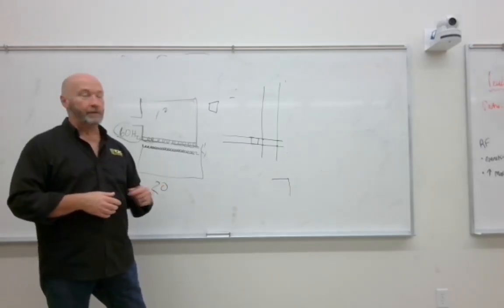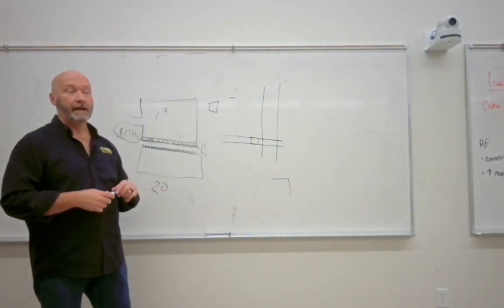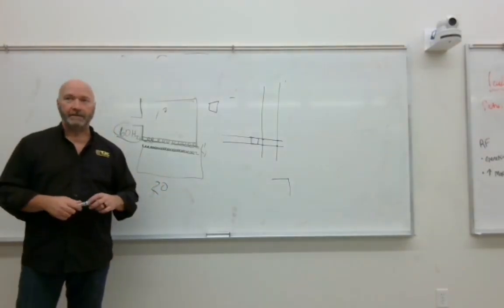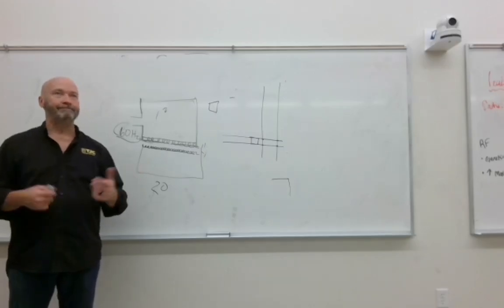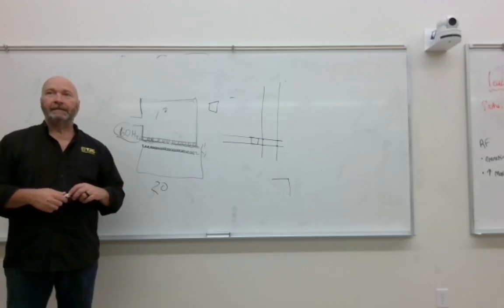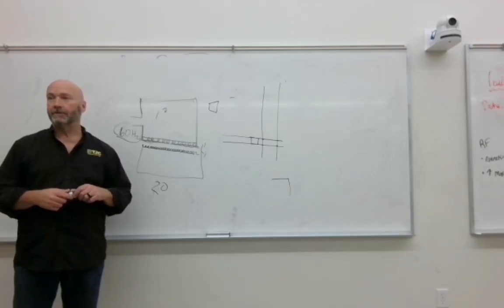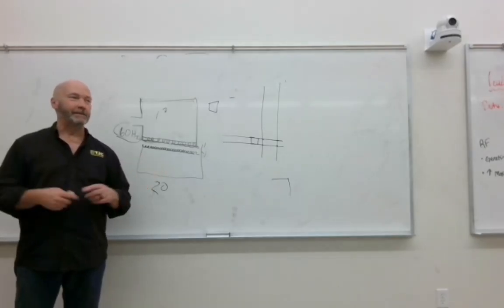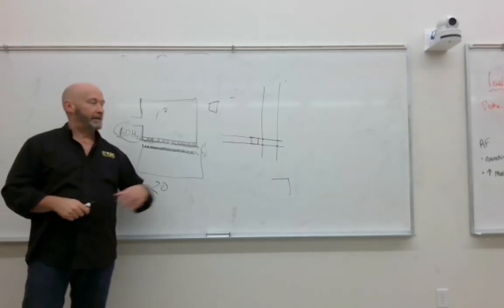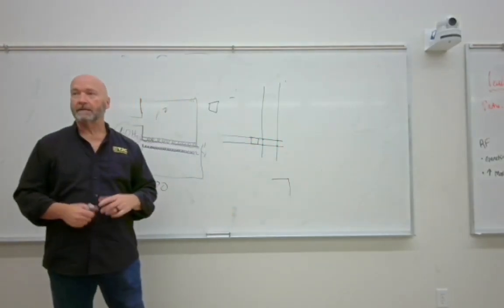It just doesn't move. As a matter of fact, that tower is very heavy. The X-ray tube in its protective housing, just that portion of it, probably weighs around 80, 90 pounds. Right? I mean, it's not like you're going to kill yourself picking it up, but it's pretty heavy, suspended from the ceiling. Now you add in all that other stuff, you got some weight there.